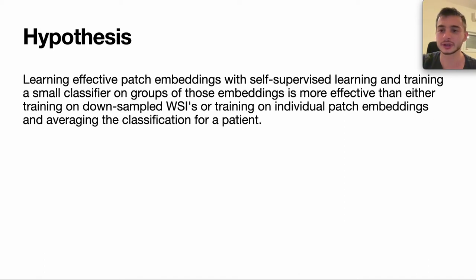We decided, well, let's train something in a self-supervised manner and then concatenate the embeddings of patches. That way you can potentially have intra-patch information learned by the network, albeit self-supervised features, and maybe it'll improve network accuracy. And basically that's what we found.